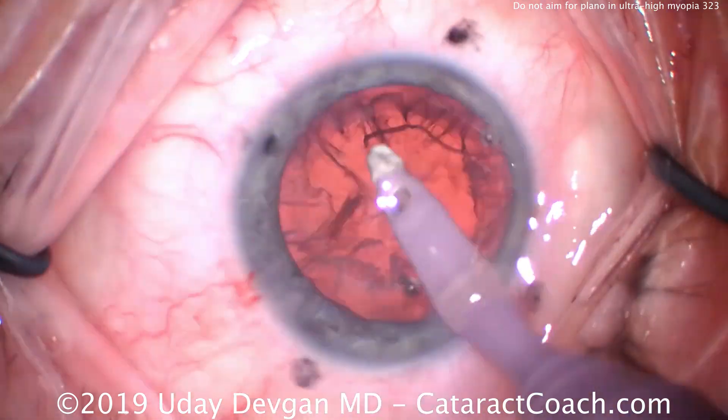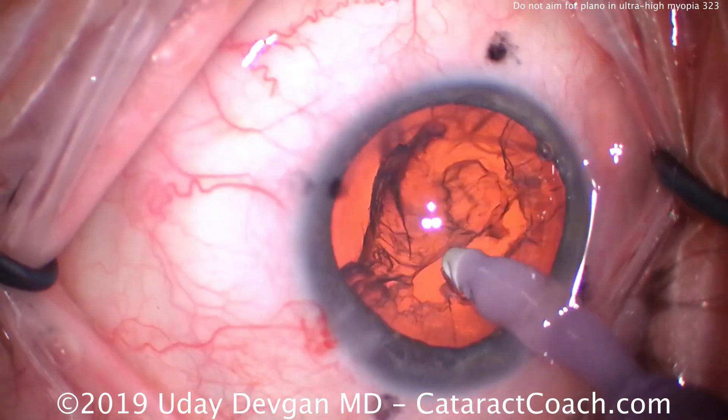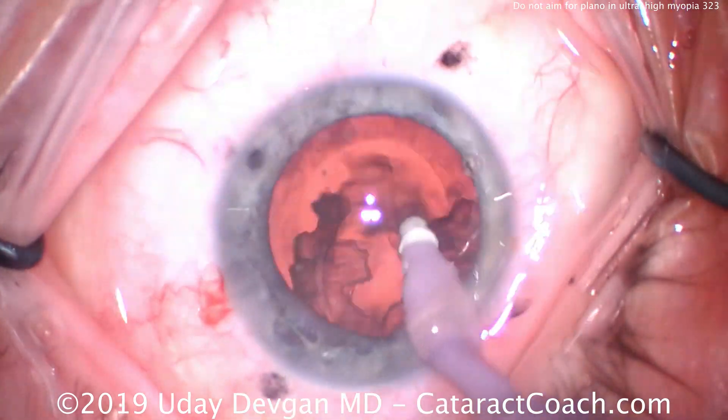Here's cortex removal — things going great. Now let's talk about the lens power. It's going to be a three-piece IOL, monofocal lens. This IOL is not available in a toric power, so that's why we're going to operate on the steep axis. And we're not going to make this eye plano.